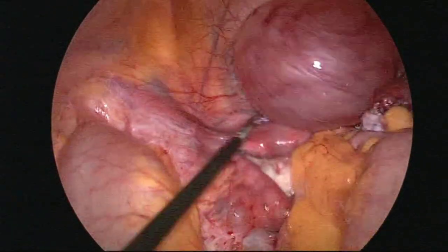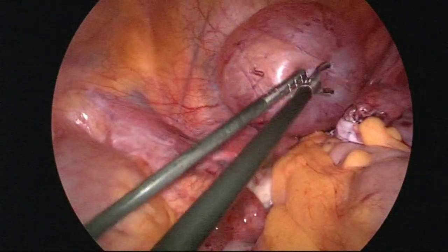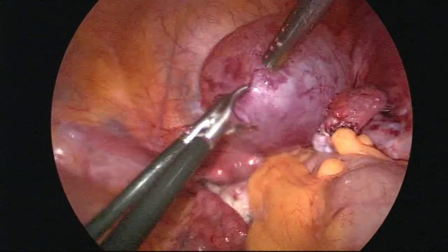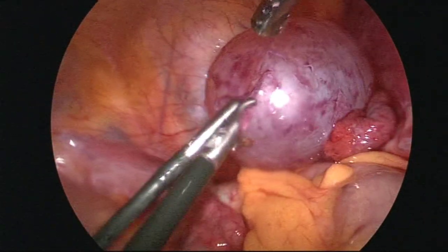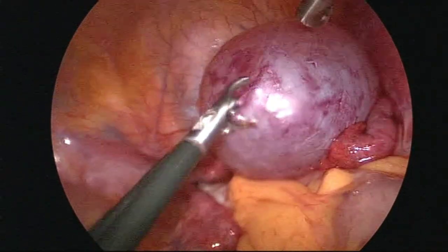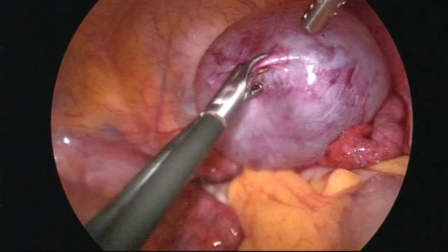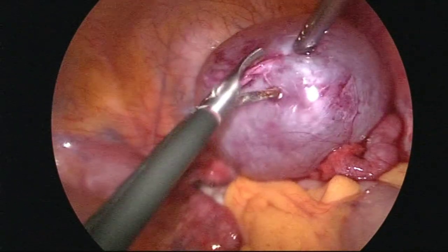Okay, now coming back to the cyst. Now we'll aspirate this, because this is a clear cyst, so there is no harm if minimal spill is there. All the tumor markers are negative and this is a clear cyst only. So first I will puncture and then I will suck it out.